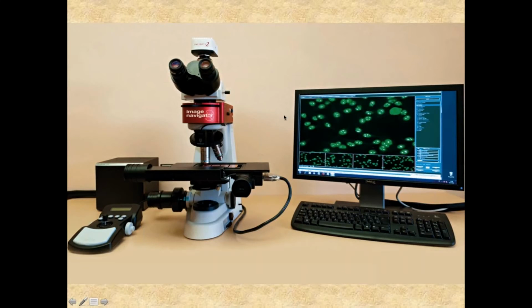What we see here on the monitor is an ANA test, anti-nuclear antibody test, which doesn't really apply to most vasculitis patients. It's a test we use often for lupus and Sjogren's syndrome, other autoimmune diseases. But we can do the ANCA test. The ANCA test is done by fluorescent microscopy as well.